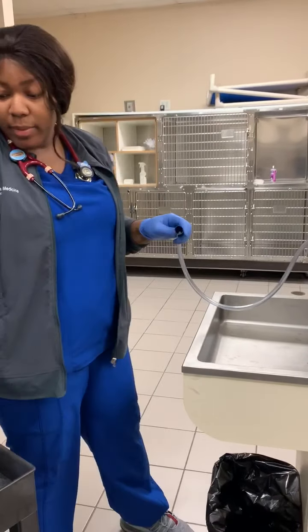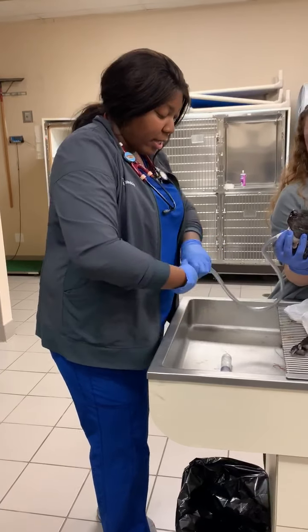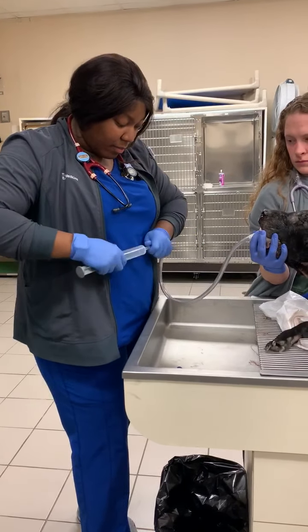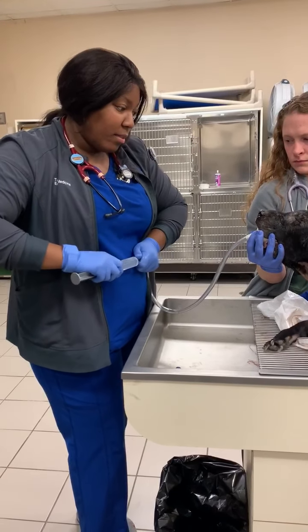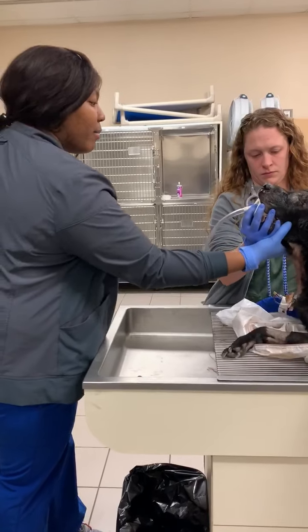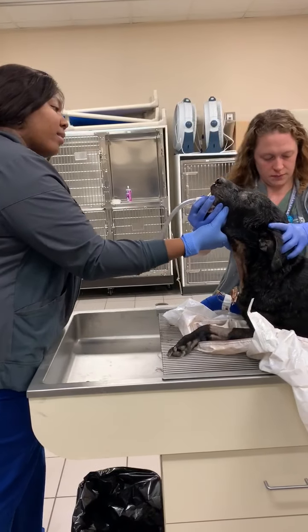Now I'm going to use my syringe, so that way you can be able to listen and make sure it's in the stomach. And Michelle, if you don't mind, try listening to see if you can hear it.